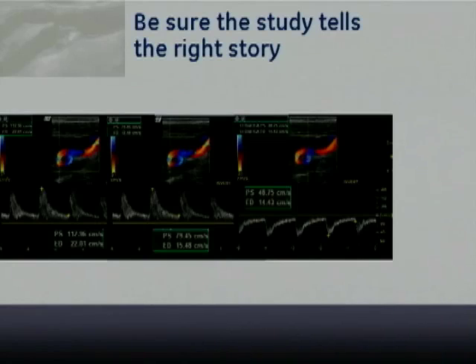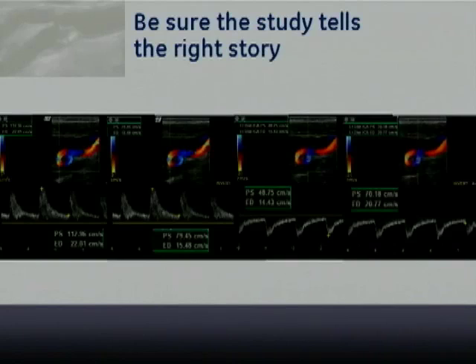Now, as I came around the coil, continuing to sample, all of a sudden I get a velocity that's 48 centimeters per second. Again, this makes absolutely no sense. It's an angle correction error. Even though the image looks like the angle correction is accurate, it's not. You update the image, double check the location of your sample volume, angle correct to the walls as it curves around. It's challenging to do, but making sure that the velocity values make sense.